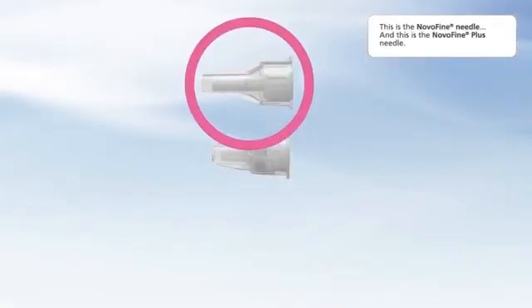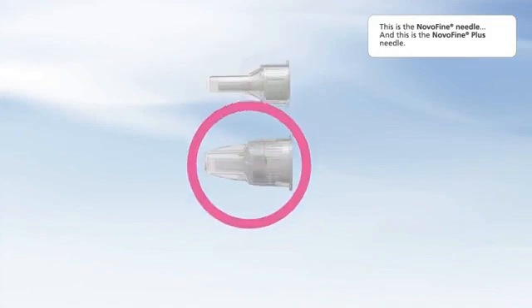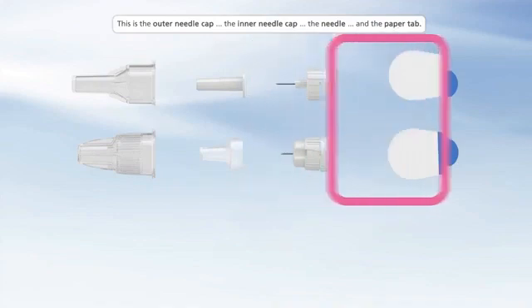This is the NovoFine needle, and this is the NovoFine Plus needle. This is the outer needle cap, the inner needle cap, the needle, and the paper tab.